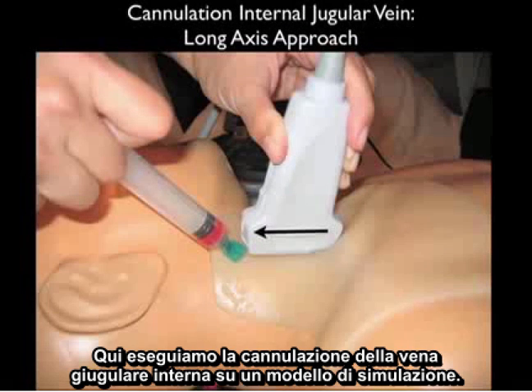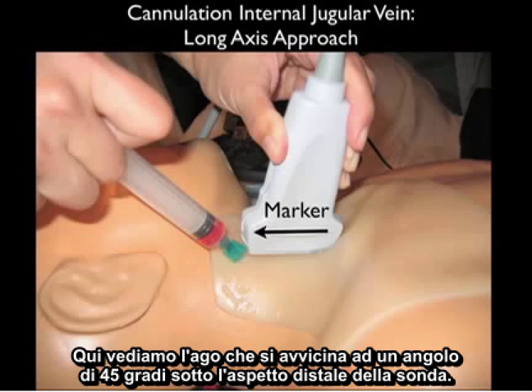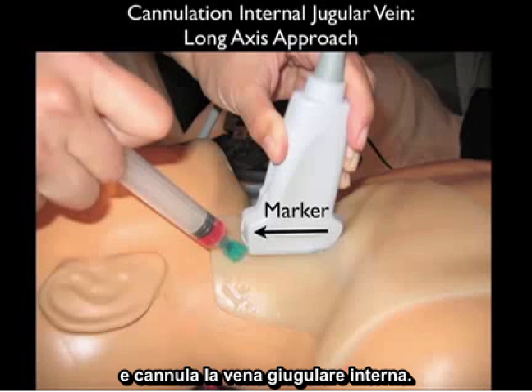Here we're performing cannulation of the internal jugular vein on a simulation model. The probe is oriented along the longitudinal or long axis course of the internal jugular vein with the marker dot distal or towards the patient's head. Here we see the needle coming in at a 45-degree angle underneath the distal aspect of the probe. This will allow us to see the entire aspect of the needle as it travels down from the surface all the way down to the venous lumen and cannulates the internal jugular vein.